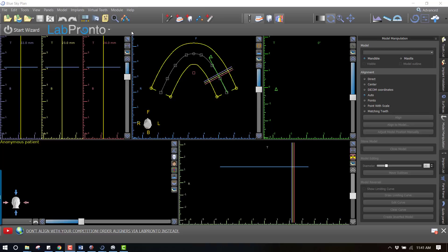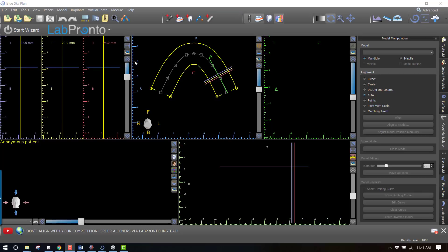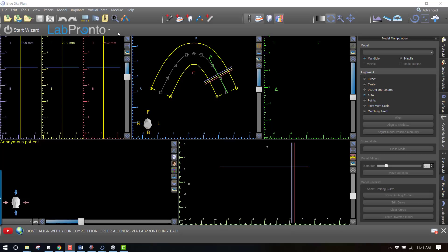In time this is going to encompass any kind of lab procedure you can think of - if you wanted to have a crown made, a bridge made, a wax up done, ortho planned, surgical guides made, anything and everything. If you don't want to do that planning yourself you can just simply outsource that into this Lab Pronto button just like you would outsource a ride to somewhere with Uber.